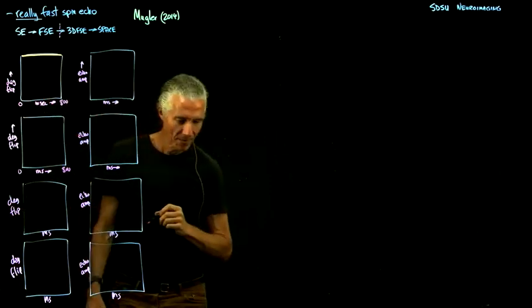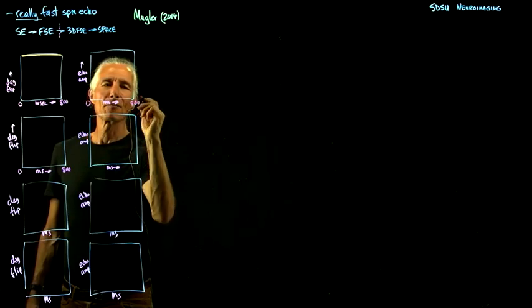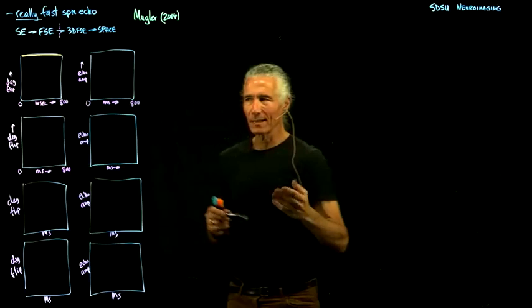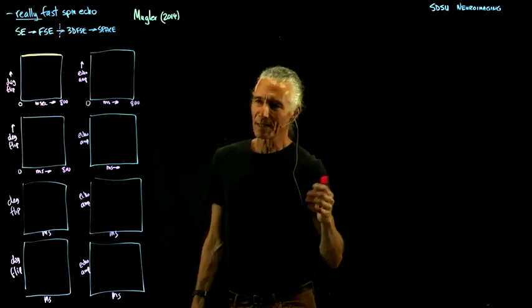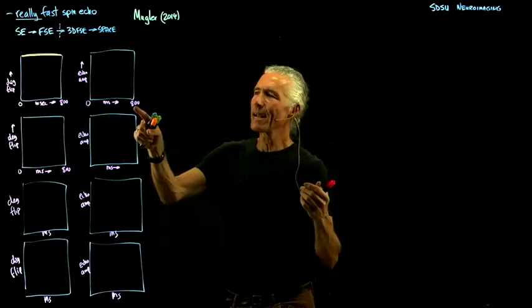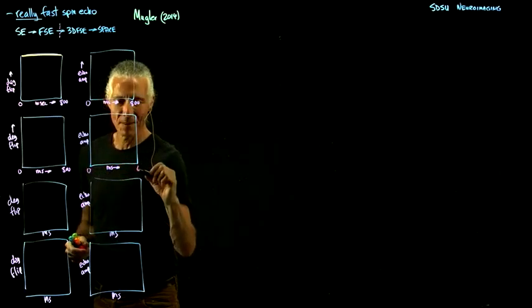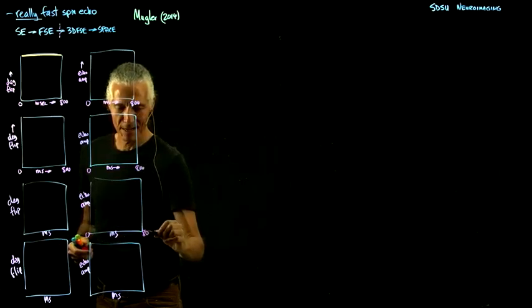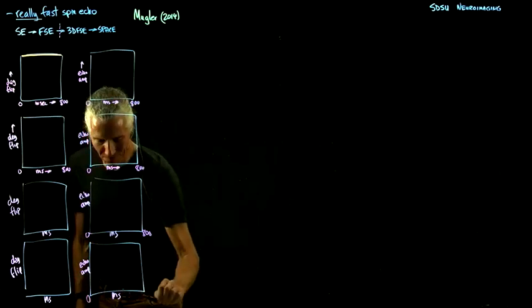So that's really, now how on earth could you get up to 800? Because we know that T2 is about, say, 50 milliseconds, something like that. So after 50 milliseconds, most of the signal has gone away. So how could you do anything at 800? That's where the stimulated echoes come in. So it's not really fast spin echo. It's like really fast spin echo plus stimulated echo.